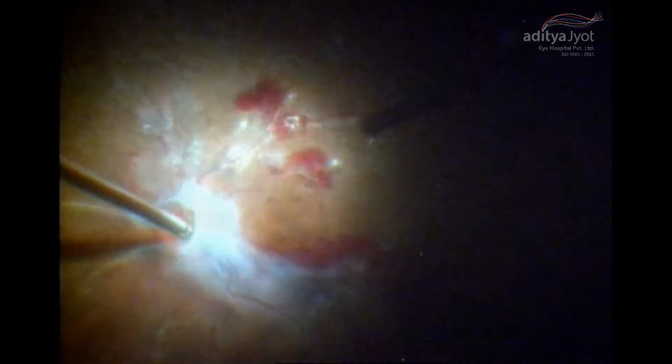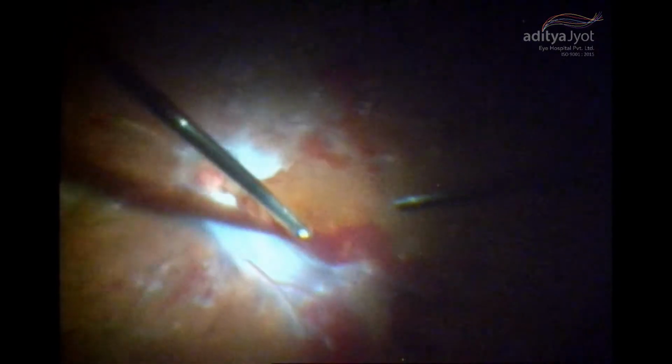And the advantage of using the 3D over the other is you can see a wide range of area and also depth, and when you magnify you don't lose the depth, and that's the advantage of using the 3D. And here I'm using the proportional mode.